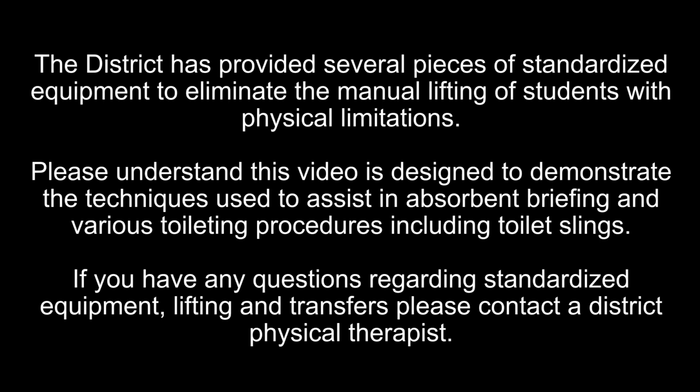The district has provided several pieces of standardized equipment to eliminate the manual lifting of students with physical limitations. Please understand, this video is designed to demonstrate the techniques used to assist in absorbent briefing and various toileting procedures, including toilet slings. If you have any questions regarding standardized equipment, lifting, and transfers, please contact a district physical therapist.